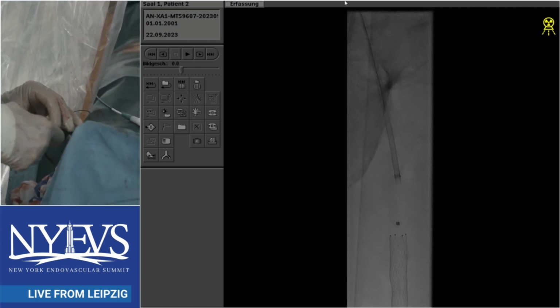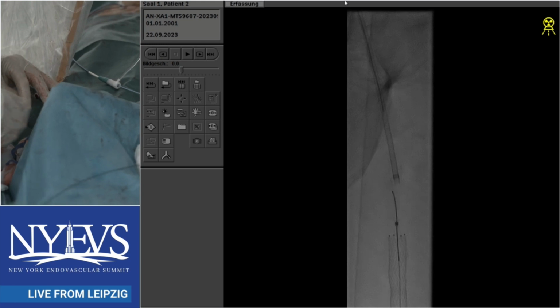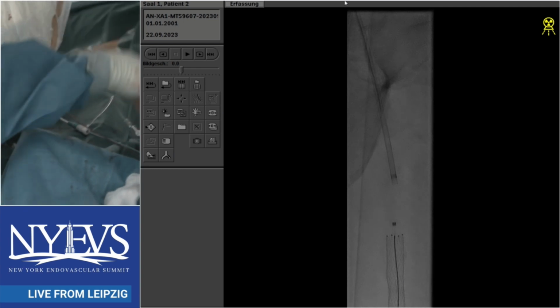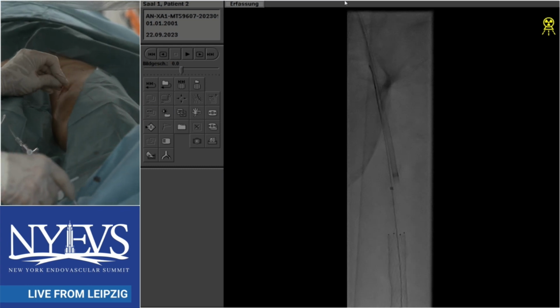I agree with you that claudication is not going to lead to limb loss, but it is still lifestyle limiting. It still hurts, it's difficult for the patient and obviously compromises their lifestyle. Would you lose anything by doing a PQ bypass in these kinds of cases? I don't know who's done them. We just got it into Sinai. You've already thrown the kitchen sink at this person with surgery and endo.